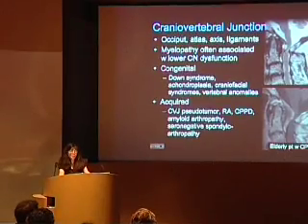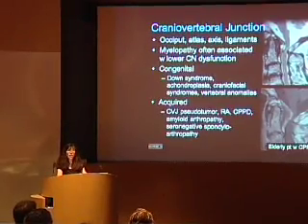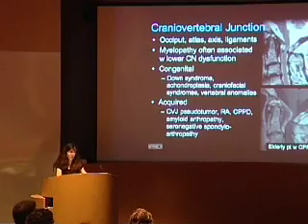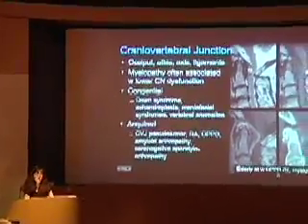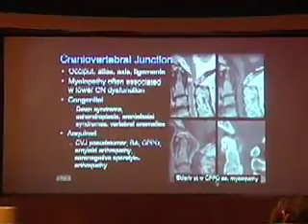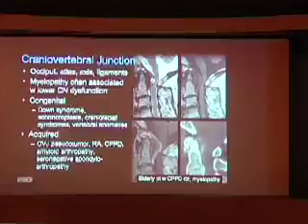And here's just an example of an elderly patient that I saw a few years ago back at UCSF who had known CPPD disease that was affecting his knees and his hips, but he then presented with myelopathy. What do we see?